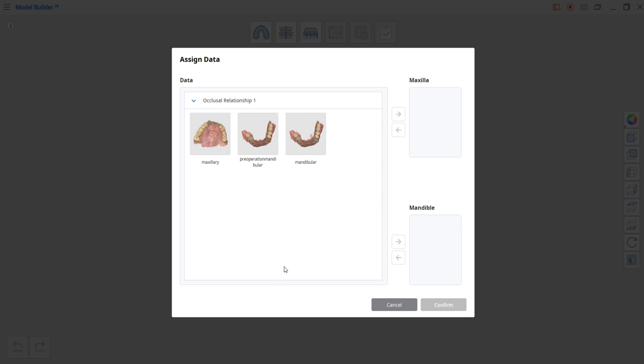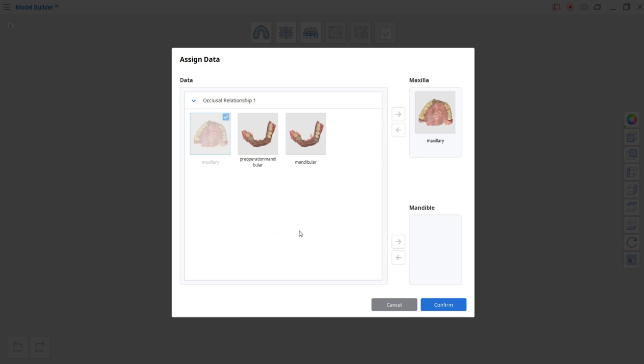On the upper right I only have the maxillary arch, and on the mandibular I have a pre-op model and an op model. Because I also want to check the crown, I am going to select the op model and assign it to the mandible.